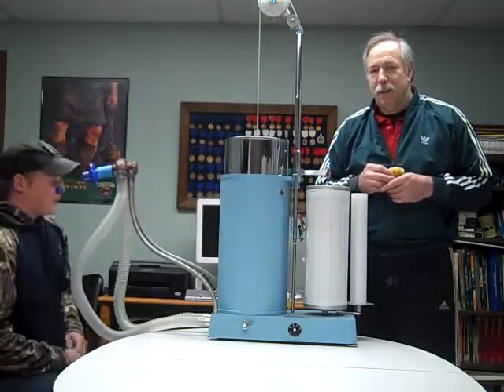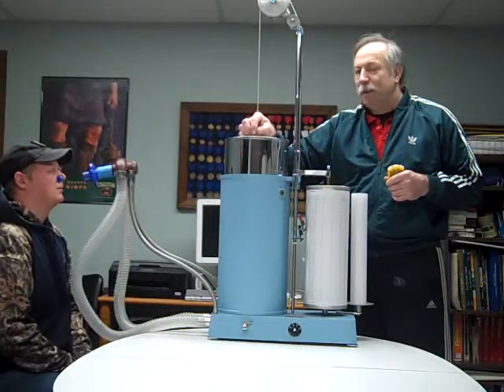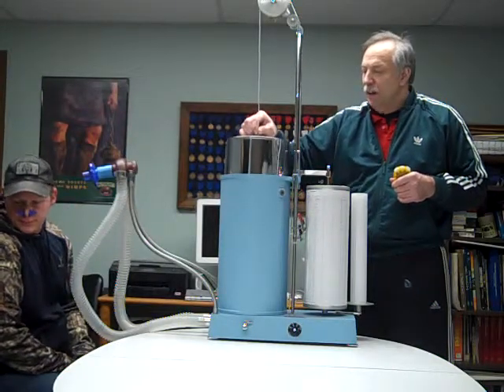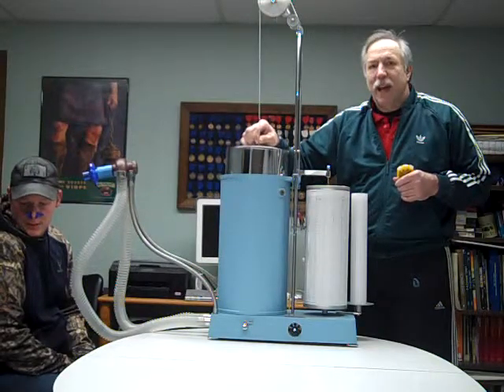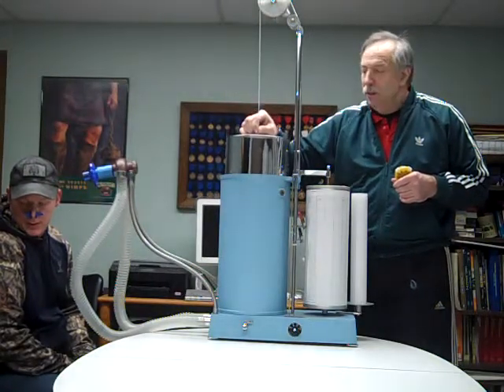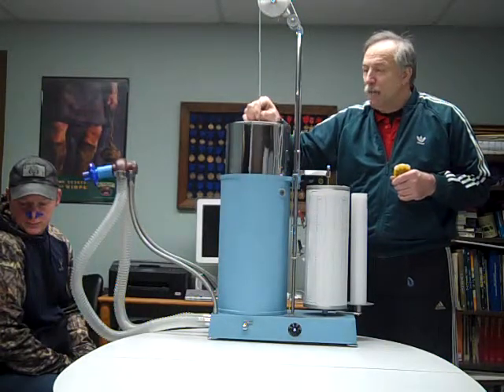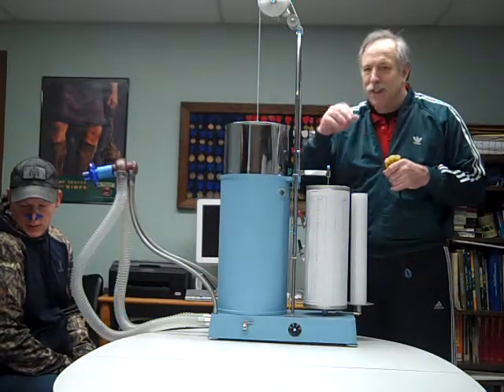What our patient will be doing is we're going to flush the air out. We'll have the valve set up, and maybe he can point his face away there for a second while I flush the air out. He's going to inhale and exhale as forcefully as possible for 15 seconds. We want the depth of his breaths to be between about 50% to 75% of his vital capacity.